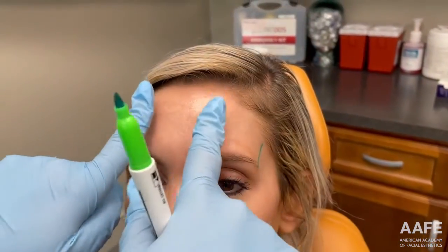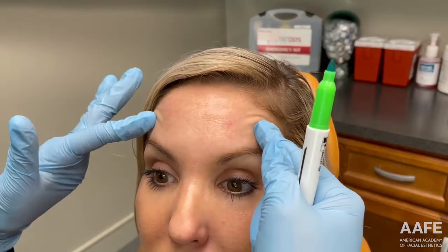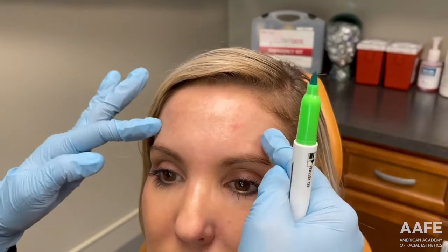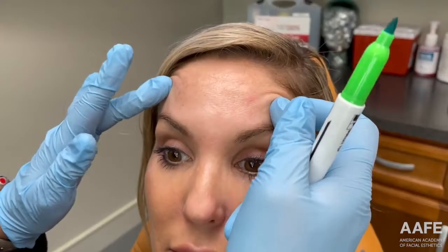So raise your eyebrows for us. It's important that you're always identifying the lateral border of the frontalis. So what that means is, where does the frontalis end? Relax and raise again so they can see. Good. So you can see here her frontalis is moving all the way out. And the reason that that's important is, if I only treated her to like mid-pupillary here to here, these muscle fibers will remain active. And so what's going to happen is she's going to start compensating with these muscles. So this area will be put to sleep and these areas will fire. So look how crazy that would look if she continued to crease laterally and then pulled this eyebrow. That's what we refer to as that Spock eyebrow.